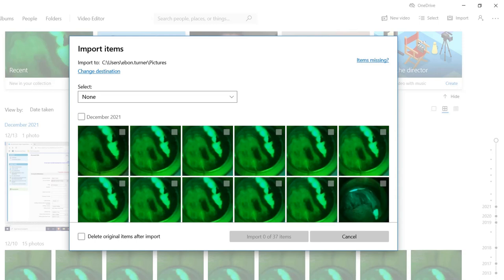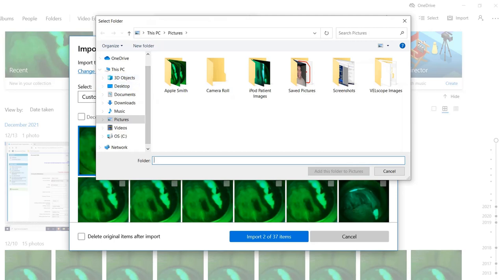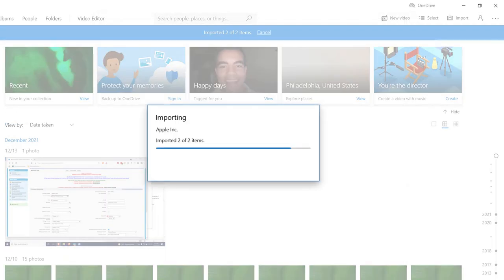At this point, we identify which images we want to transfer. My recommendation is to determine what folder you want to transfer those to — whether that be directly to the patient's chart if you can do that with your practice management software, or if you want to put it onto a separate folder to transfer later. So we're just going to say we've set up a folder, Apple Smith, and those images are going to be transferred to that folder.